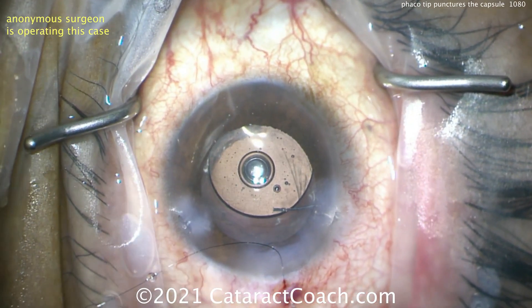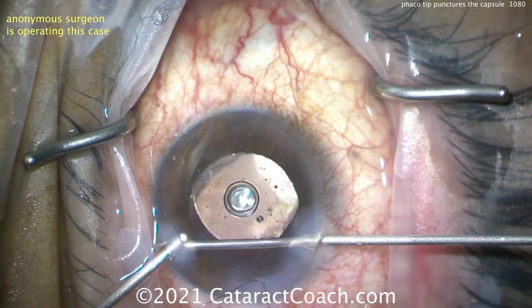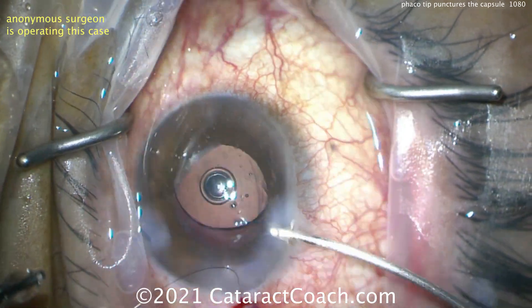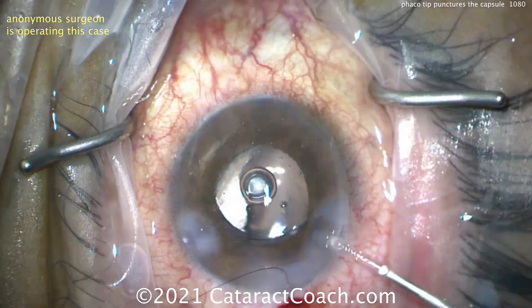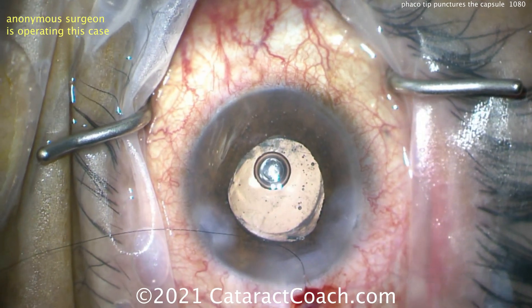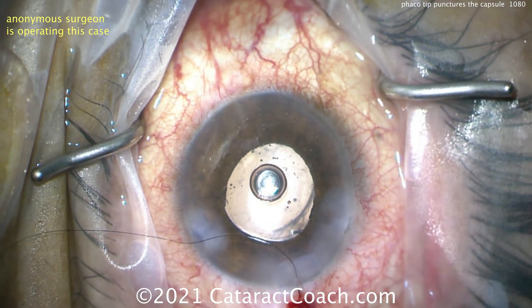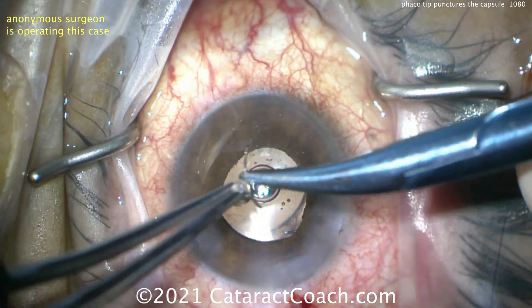Do not leave this eye with vitreous in the anterior segment — take your time, really make it clean. That's still not sufficient, so we're going to have to do a little more work here. Hands being switched — now we need to get over that area of prolapsed vitreous and clean it up. Sweep around more, make sure there's no more prolapsed vitreous. Every time we come out of the eye and let the IOP depressurize, that lens optic comes forward and there's risk of vitreous coming forward. Now that's looking a lot better in terms of lens position.